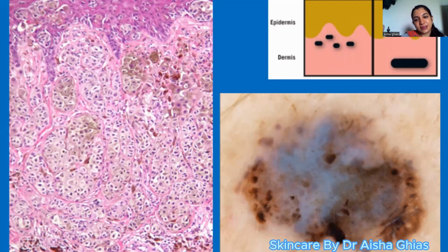In the previous lectures we already learned why blue seems blue, why brown looks brown, why we see these colors in dermoscopy and what their interpretation is. So let me tell you again that blue color denotes that melanin, free melanin or melanocytes are there down in the dermis. They are not supposed to be there. Once they're there, it raises the suspicion for a lesion to be malignant.